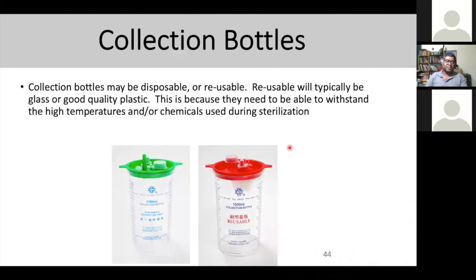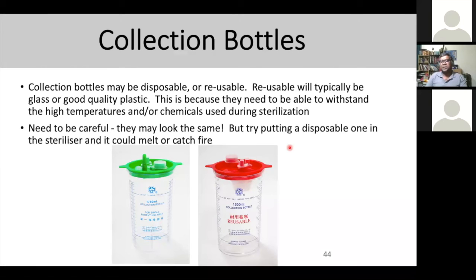There are two types of collection bottles: one is disposable, single-use — once used, it must be disposed of. The other is reusable — glass or good-quality plastic that can withstand high temperature or chemical sterilization. When cleaning the reusable bottle, make sure you keep the particular floating part back in the system. If not, you're going to get overflow into the pump.